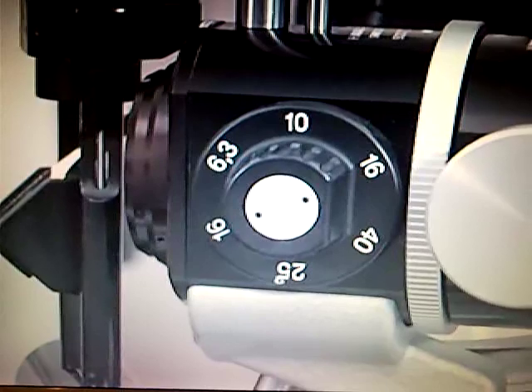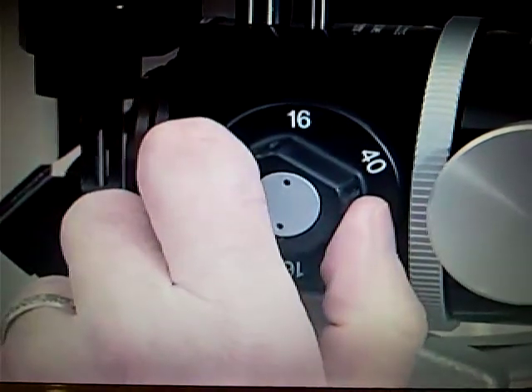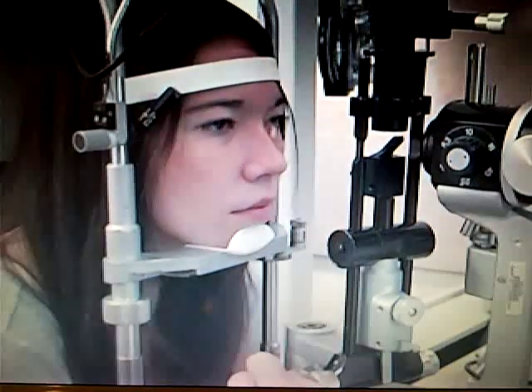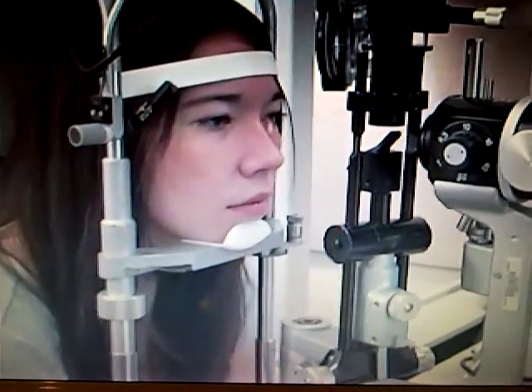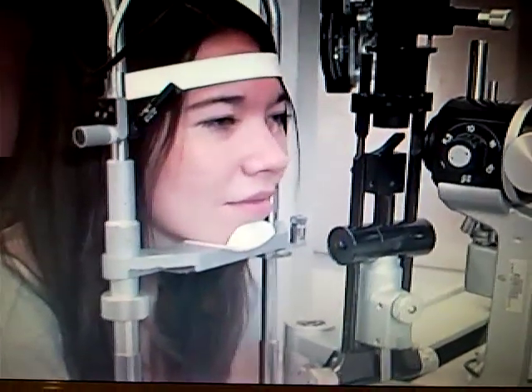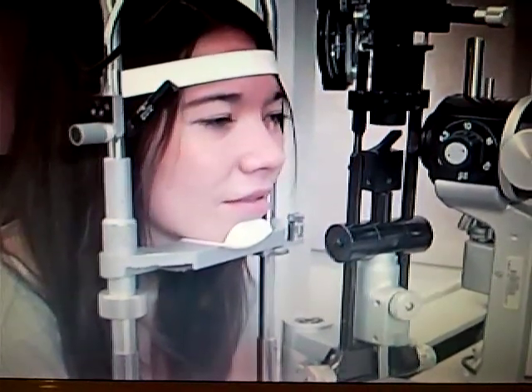We typically begin with the slit lamp power at 10x and can increase the power as needed throughout the examination. The room light should be dimmed for gonioscopy. In this video the room is bright to allow the video to be performed, but typically the room light should be down. Similarly, the slit beam should be short so that it does not shine into and constrict the pupil, artificially opening the iridocorneal angle.